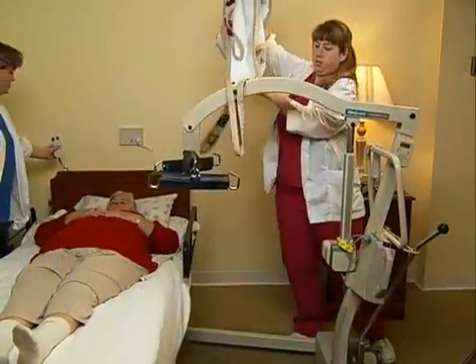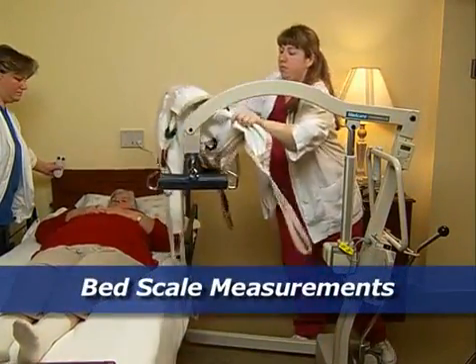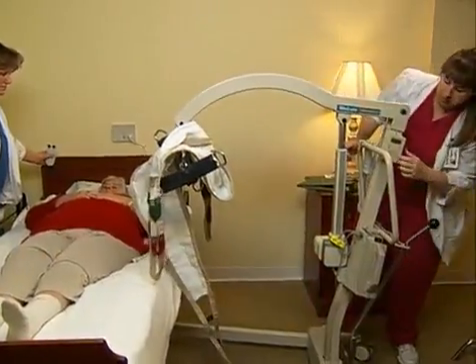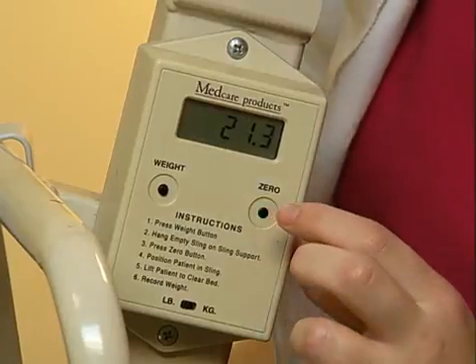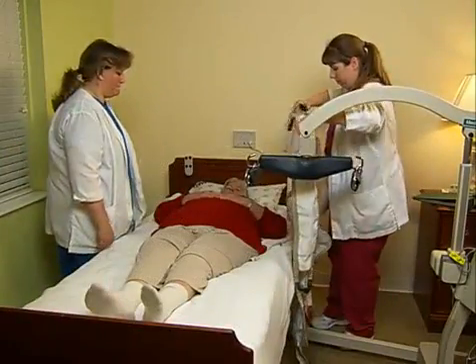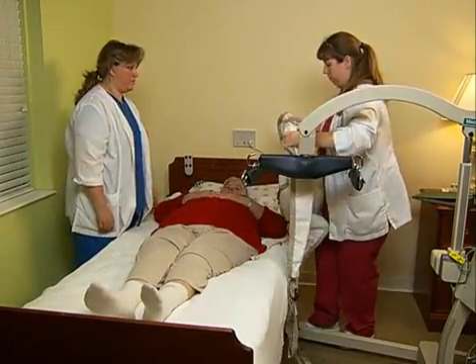If a patient can't bear weight, use a bed or lift scale. To prepare for this, place the sling on the arms of the scale. Calibrate the scale to 0 with the sling on the scale to account for its weight. Remove the sling from the scale.